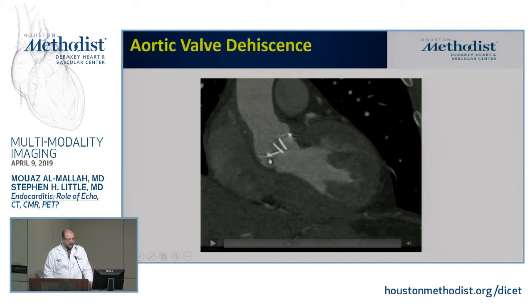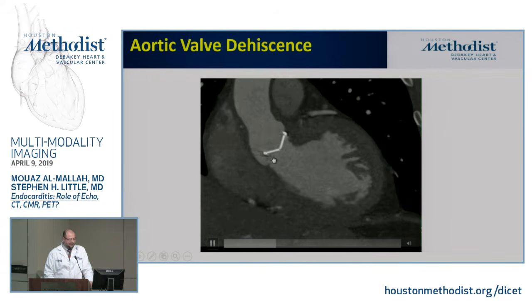We can also look at aortic valve dehiscence. This is one of the very first cases that I've read here, where you can see this ring is moving around.